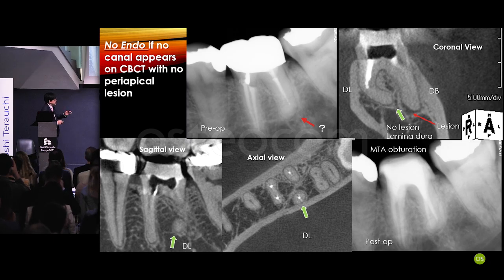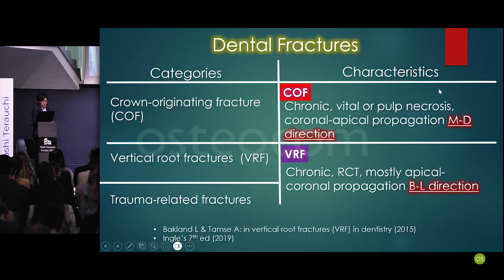It's not necessary. There's no benefit of penetrating the calcified canal in the distal lingual canal. So I didn't touch the distal lingual canal. I just retreated the distal buccal root. Then the patient immediately became asymptomatic. And this is post-op. Of course, I told the patient I will not touch the distal lingual canal because there's nothing wrong with the distal lingual canal.